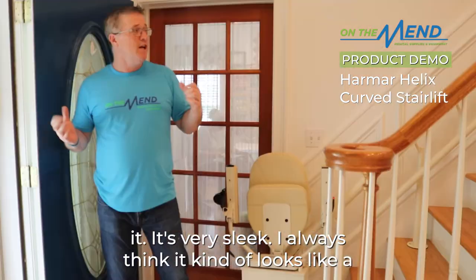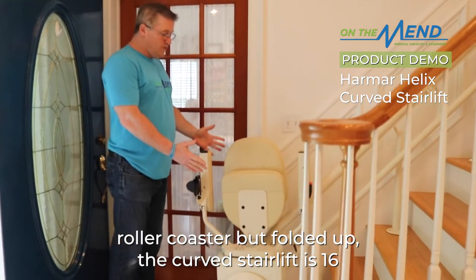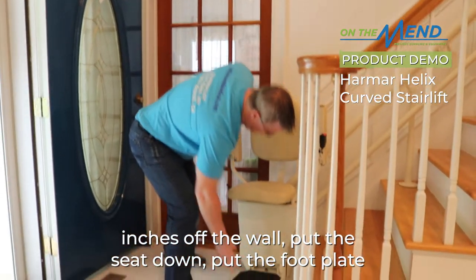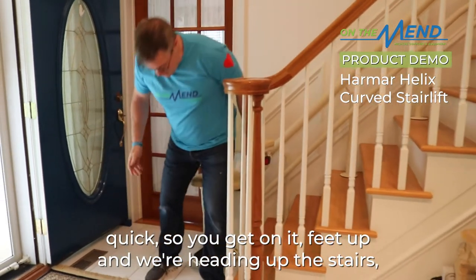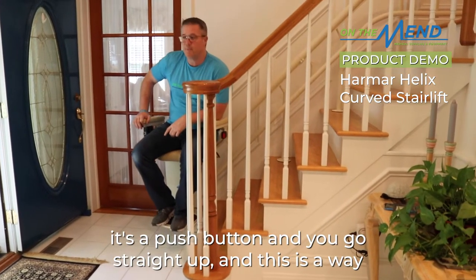It's very sleek — I always think it kind of looks like a roller coaster. The curved stair lift sits 16 inches off the wall. You fold it up, put the seat down, put the plate down, put the handles down, and you are in business. You get on it, feet up, and you're heading up the stairs — it's a push button and you go straight up.